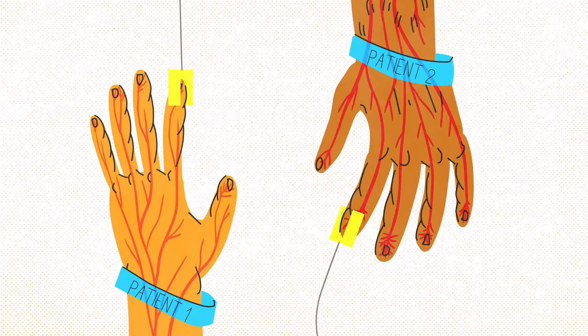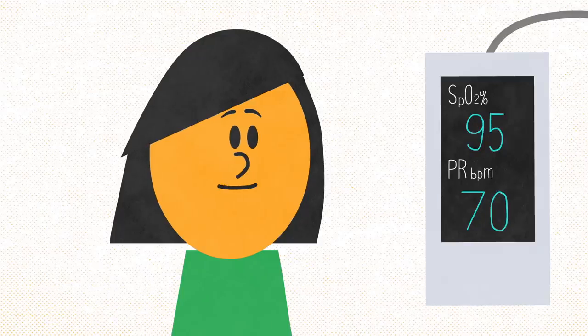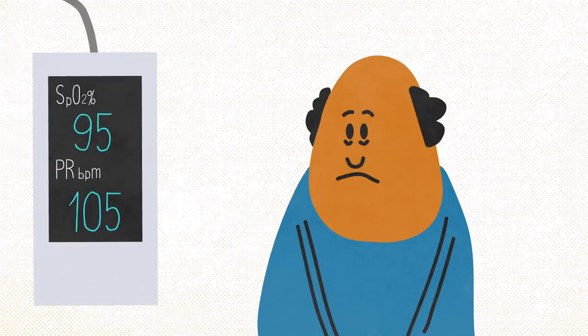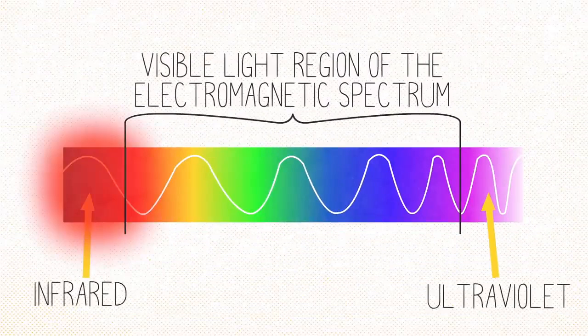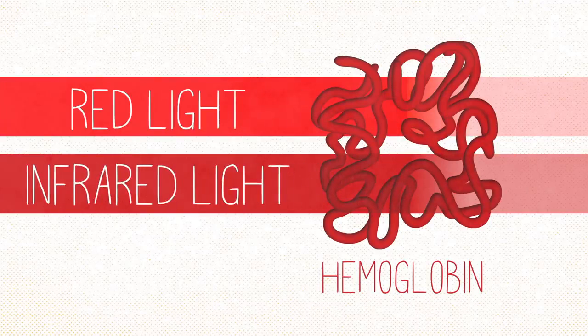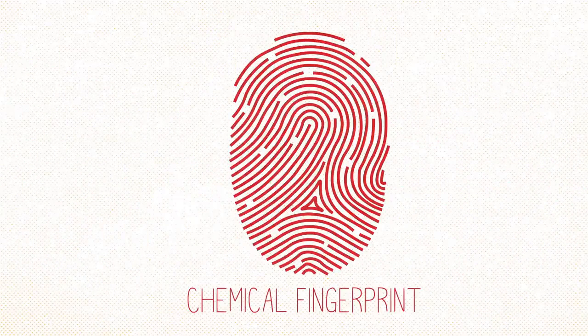But any two patients will have different sized blood vessels in their fingers. For one patient, a saturation reading of 95% corresponds to a healthy oxygen level. But for another with smaller arteries, the same reading could dangerously misrepresent the actual oxygen level. This can be accounted for with a second infrared wavelength LED. Light comes in a vast spectrum of wavelengths, and infrared light lies just beyond the visible colors. All molecules, including hemoglobin, absorb light at different efficiencies across this spectrum. So contrasting the absorbance of red to infrared light provides a chemical fingerprint to eliminate the blood vessel size effect.